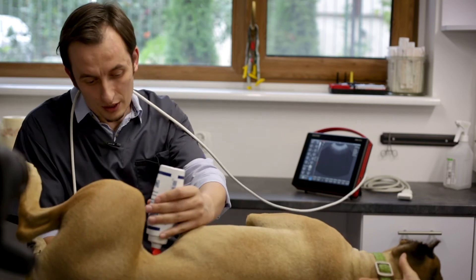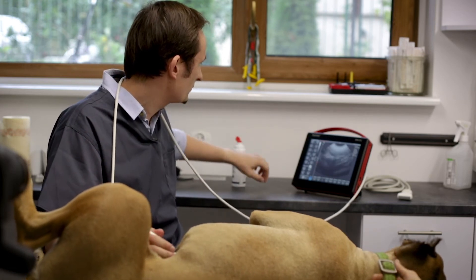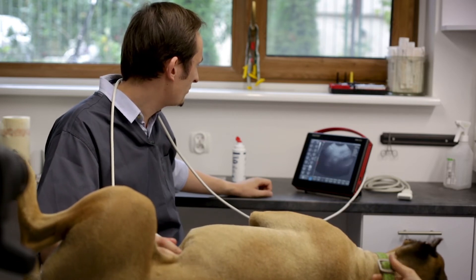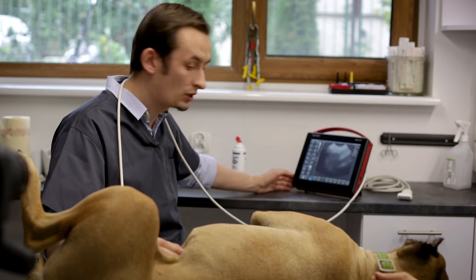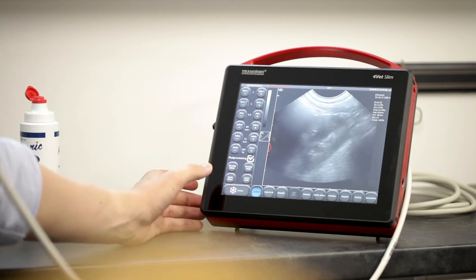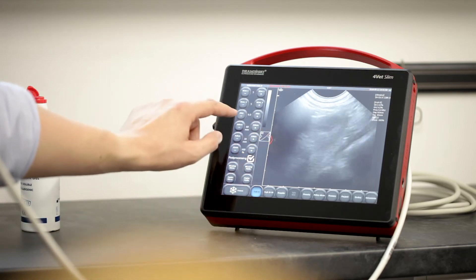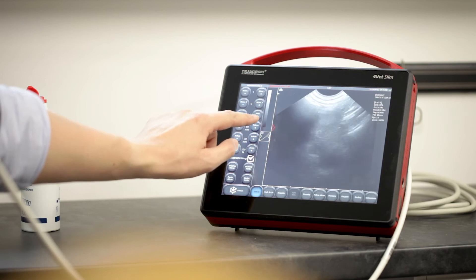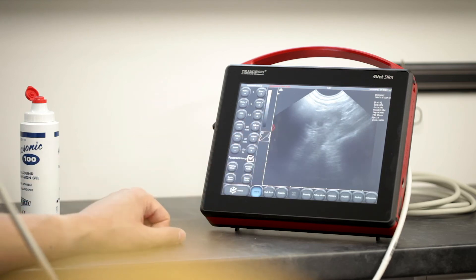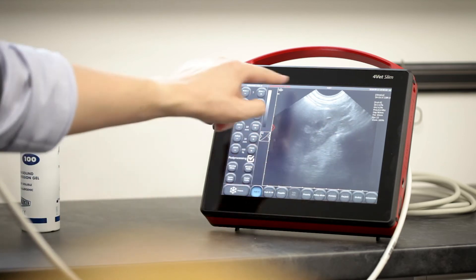Let's go to the kidney. We should do the same things that we did with the urinary bladder — we should remember about adjusting the brightness of the screen, so we can see the kidney appearing here. We should remember about focus, about the frequency, and the depth of scanning. Right now the kidney takes up about two-thirds of the ultrasound window, so we can see the structure of the kidney and also what is around it.